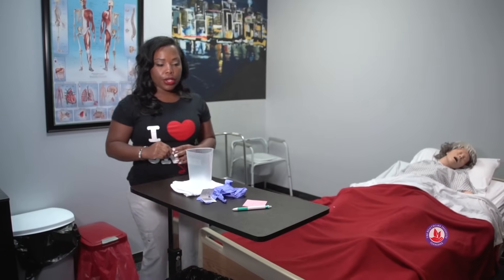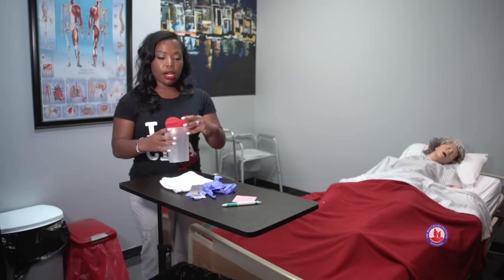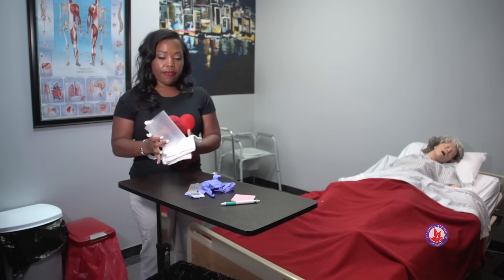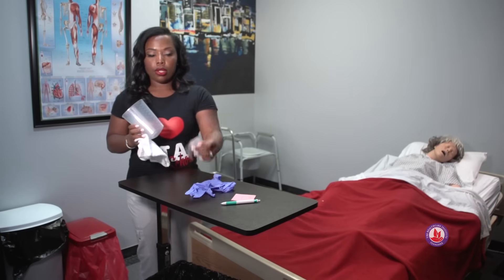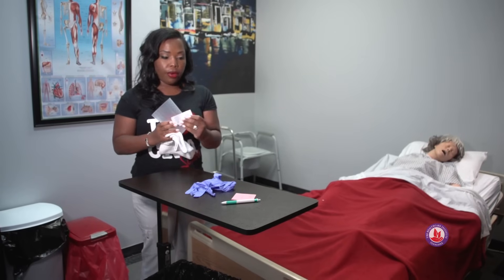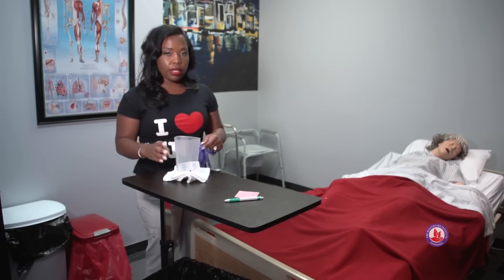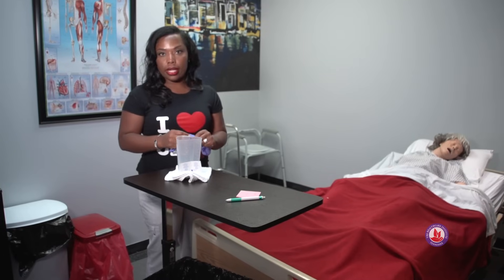For emptying a urinary drainage bag, the supplies that you'll need are your graduated cylinder. You'll also need a barrier for the graduated cylinder. You'll need alcohol wipes for the drainage too, and then you'll need gloves. We don't put the gloves on until after we've prepped the area and are ready to start.